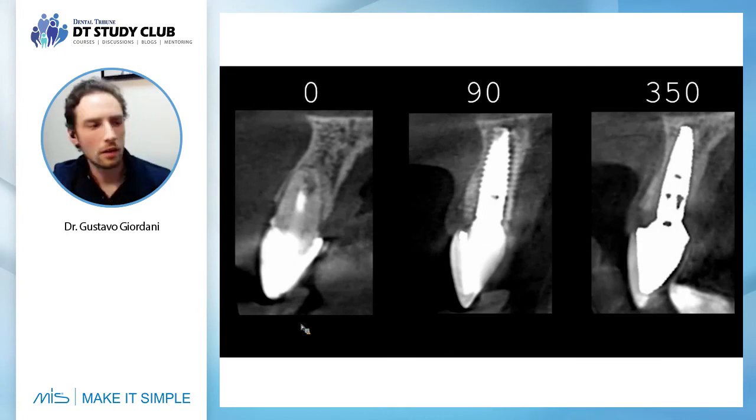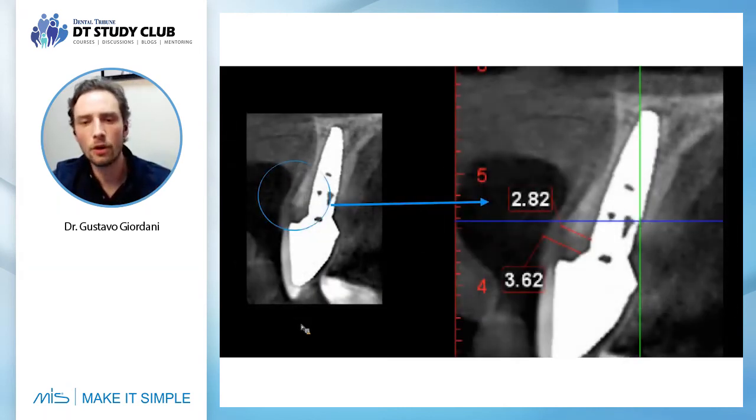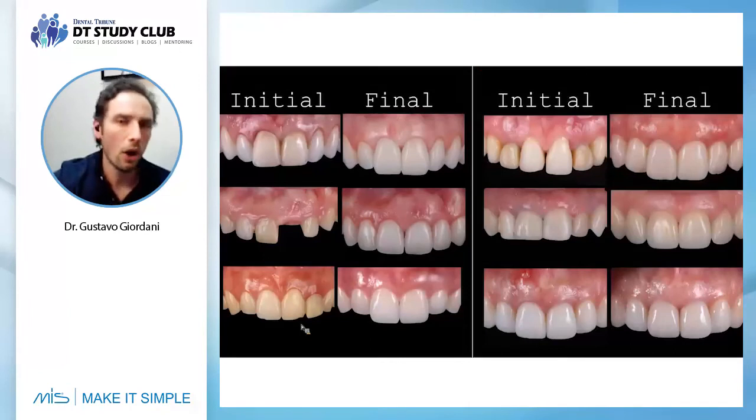When you use the V3, the bone around the implant is very stable. When you use connective tissue graft, everything looks very stable. And as you can see here in the tomography, we have everything that we discussed. Implant in the correct position, buccal bone to protect the implant and to have a rigid support for the soft tissue. Soft tissue thickness of more than 2 millimeters. We have here more than 3 millimeters. So this is very stable. With this, the literature and also our clinical experience show that this is very stable. So we are using this as a protocol in all of our cases.